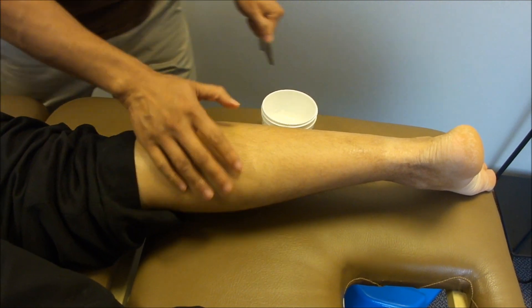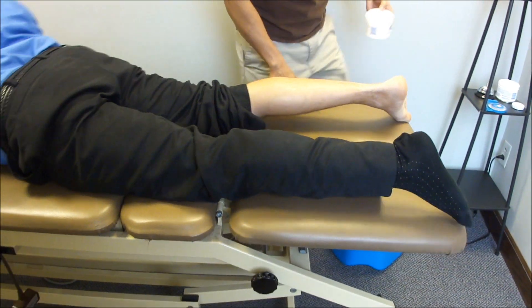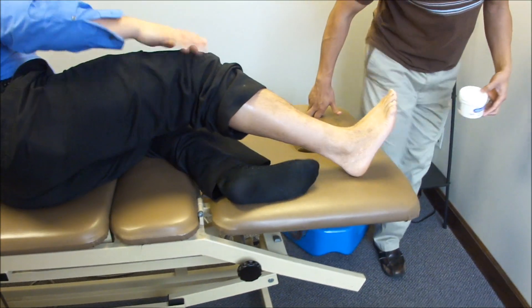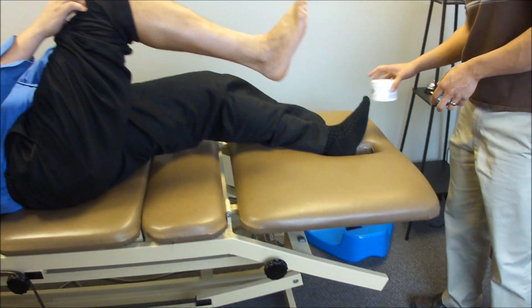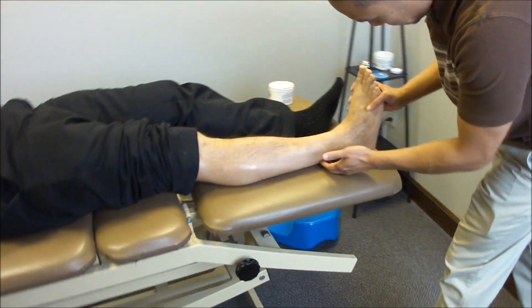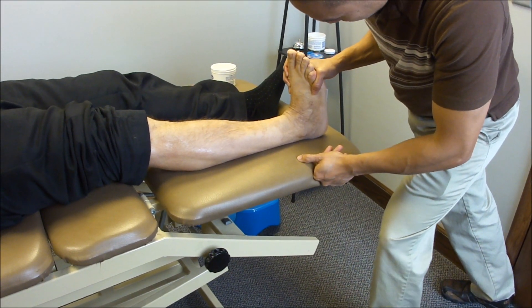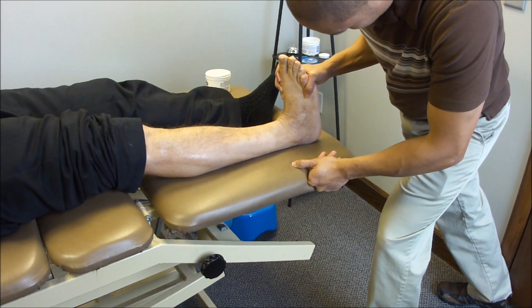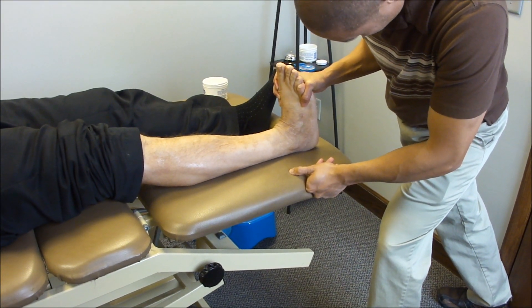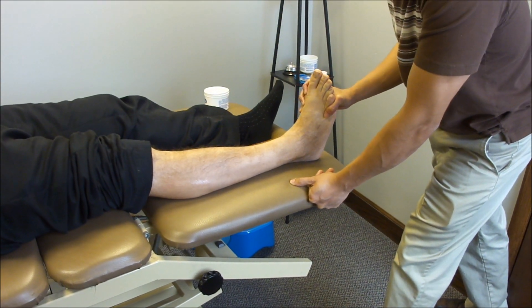Let's re-measure his dorsiflexion. I'm not sure if that's going to do too much. Actually, the end feel is a bit better, and he might have about five degrees now — so it is a little bit better.